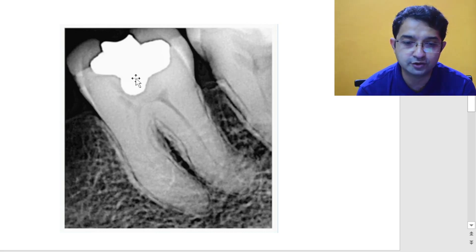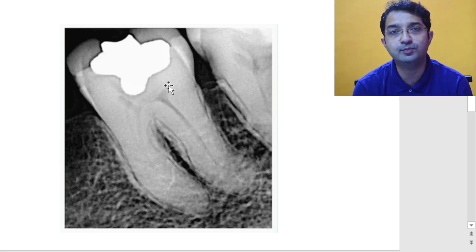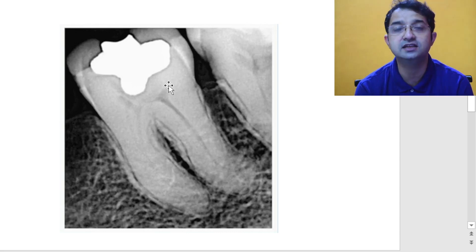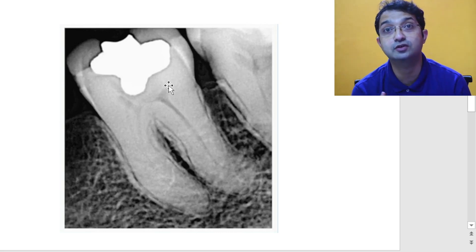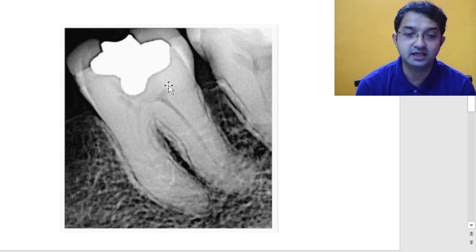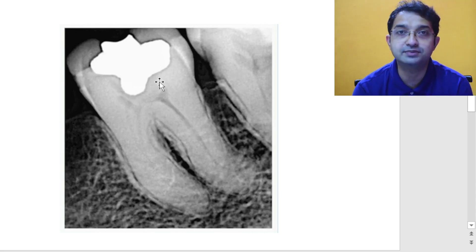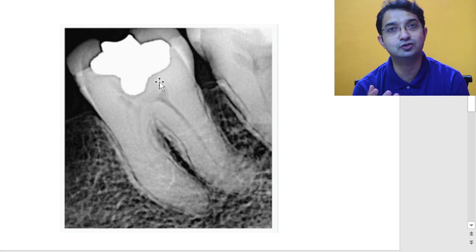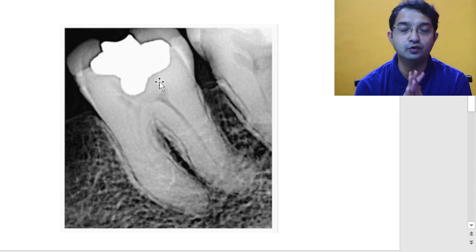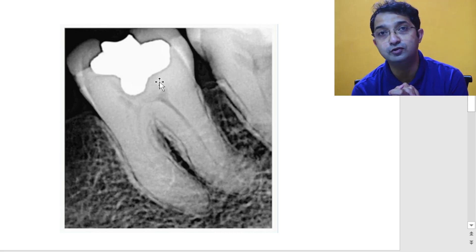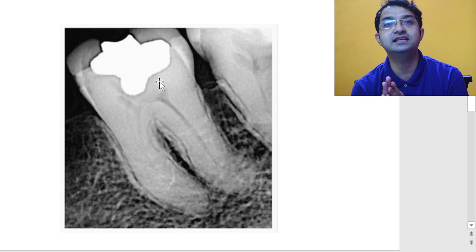Apart from that, you can also appreciate that the pulp chamber is not clearly seen, which is very common when you have a long-standing restoration. This stimulates the pulp to deposit secondary dentine or reparative dentine due to chronic irritation, causing the pulp chamber to gradually reduce. Whenever you see absence of a pulp chamber, anticipate that access opening will be really difficult — you will have difficulty finding the orifices, and if you keep drilling in the center you may end up with a perforation.